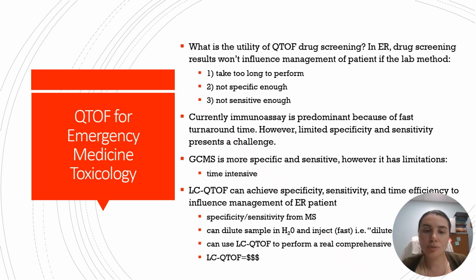And so you could use a QTOF to perform a real-time comprehensive drug screen. Now, of course, the drawback is that typically QTOF systems can cost a lot of money, so not all medical centers will have access to this necessarily.